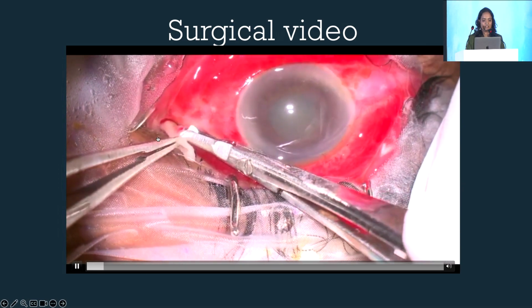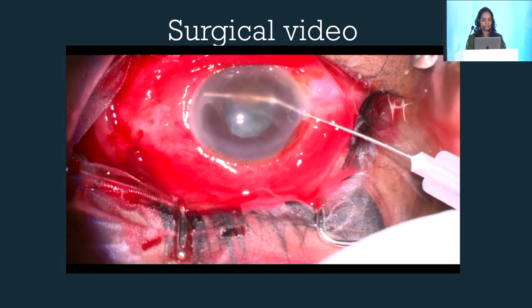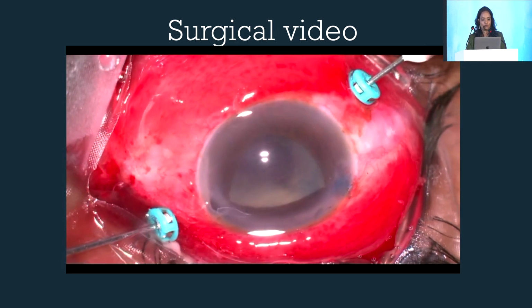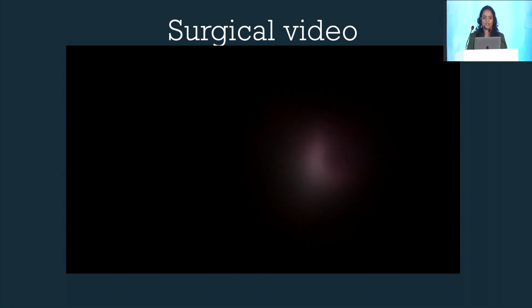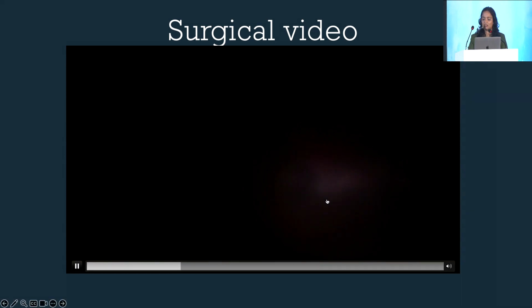So I just did cut the retina flush with the sclera. After that, the AC exudates were cleared. The lens was removed, and you can see just behind the lens there is a lot of necrosis, so we cleared that. Now when we go in, there is no view at all. There is a lot of vitreous hemorrhage, some necrotic tissue seen.